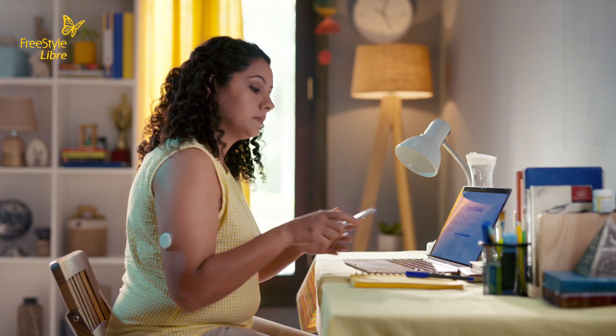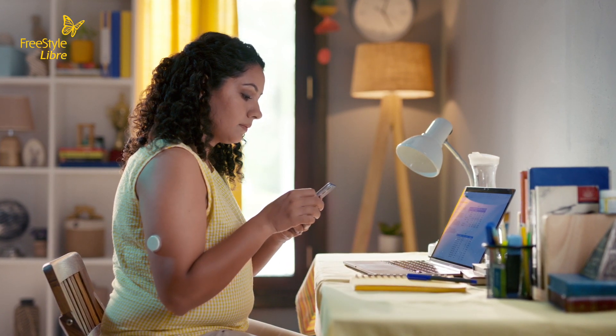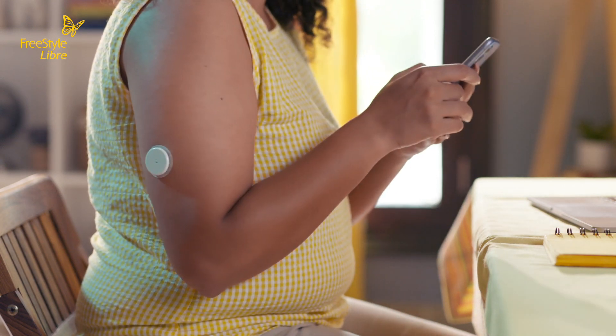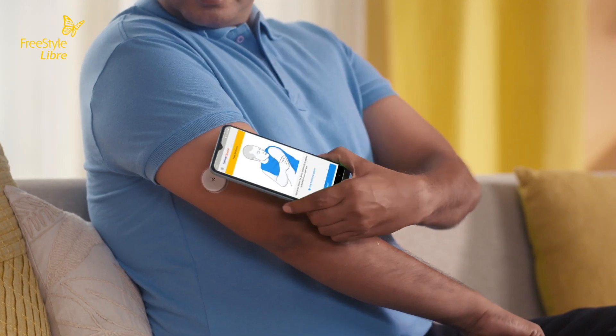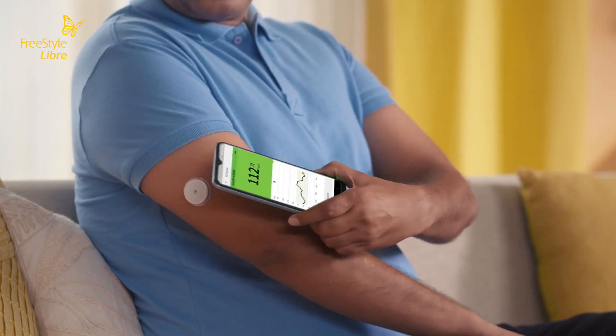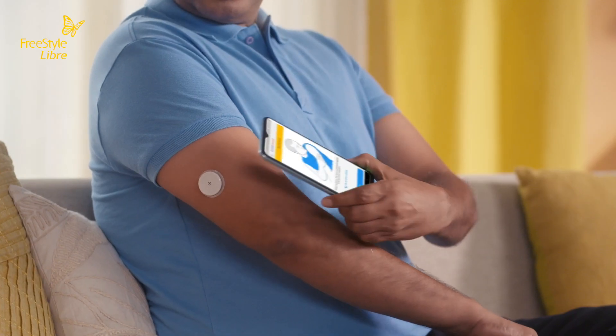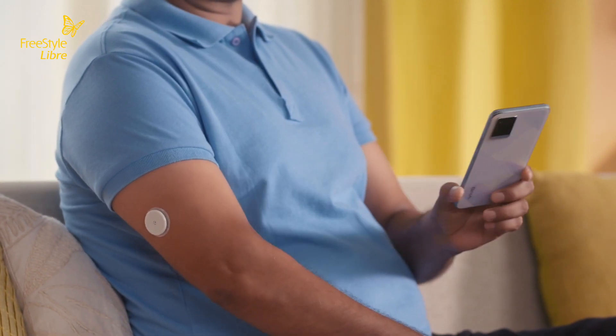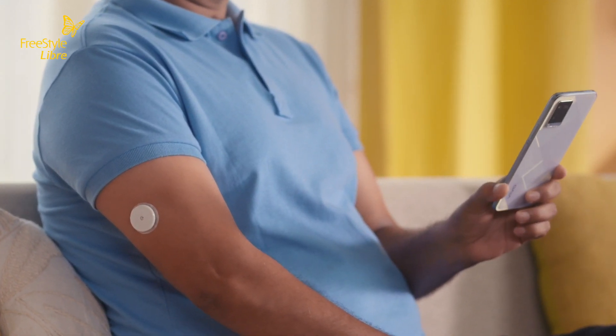To activate the sensor with your Freestyle Libre link app, scan your sensor with your phone until you hear a beep and your phone vibrates. For Android users, position the back of your phone close to the sensor and scan it. Each Android phone model varies, so you might need to adjust the phone's position to find the correct position of the NFC transmitter antenna. Keep the phone over the sensor until you hear two tones — wait for both tones if your phone volume is on.